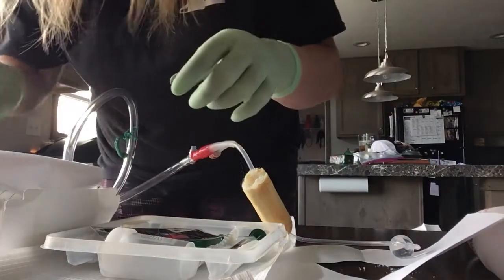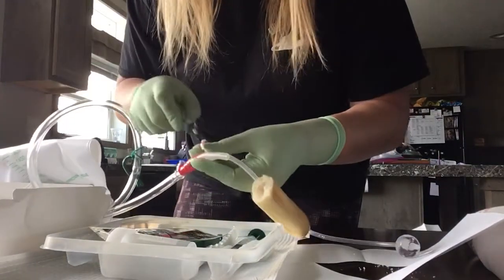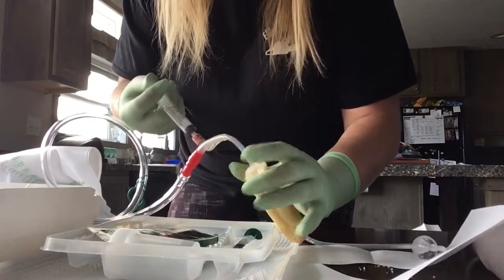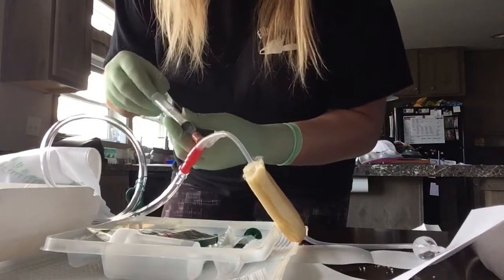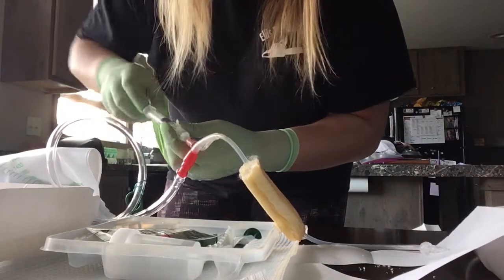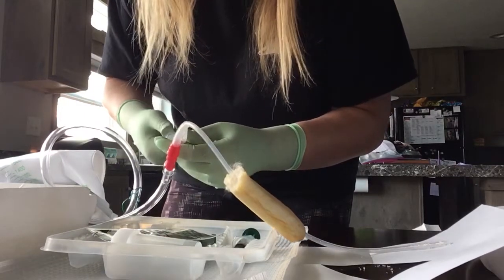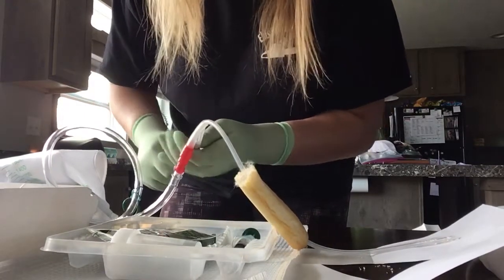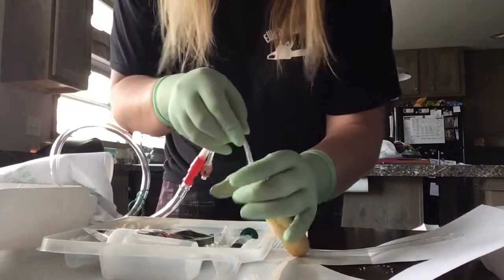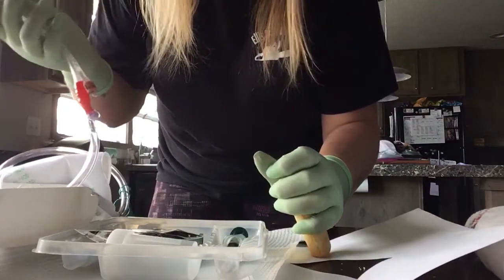To take it out, put this right on this port and just pull out. But you want to make sure that you withdraw the same amount of fluid as you put in — I see I got ten in here, and that's how much I put in. Then you can just pull it right out.